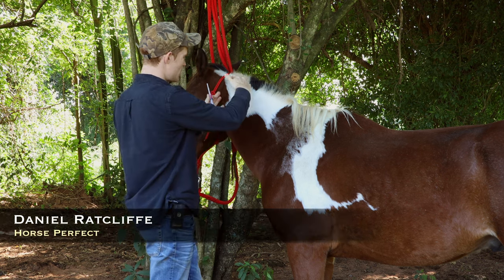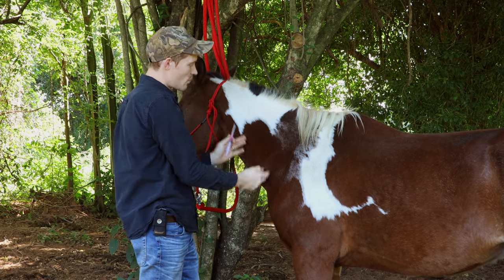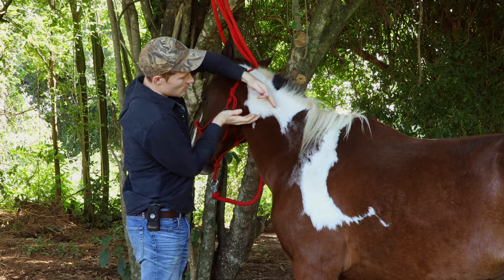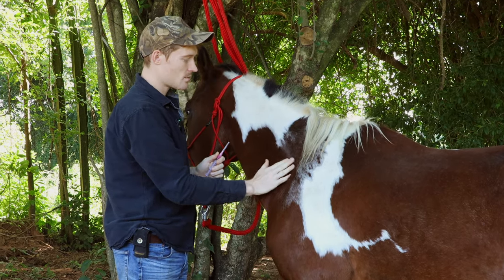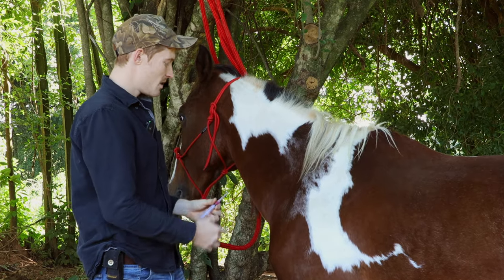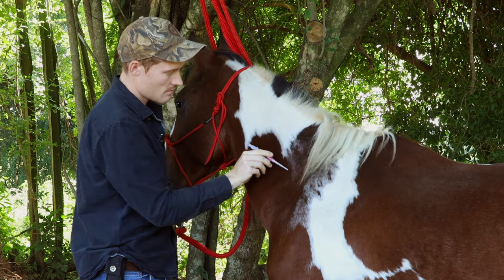Looking at the horse's neck here, you can see that he's got a pretty triangle neck. Right here, a little bit to the inside of his neck, we can just kind of draw an imaginary triangle right here. What you want to do is vaccinate your horse somewhere in this triangle. Right here is where there's nice thick muscle and it's safe to vaccinate them there. You don't want to be poking them up here or anywhere near the edge of the triangle. The ideal spot is going to be right here.